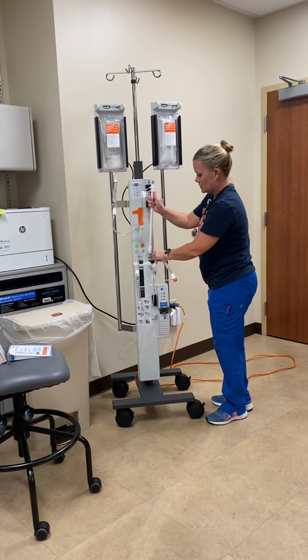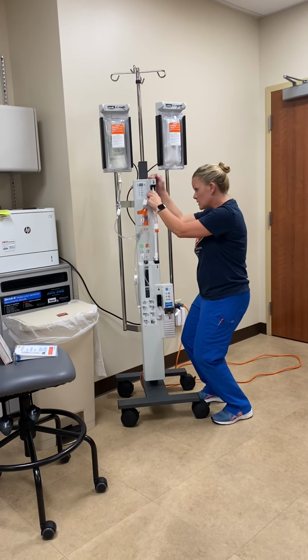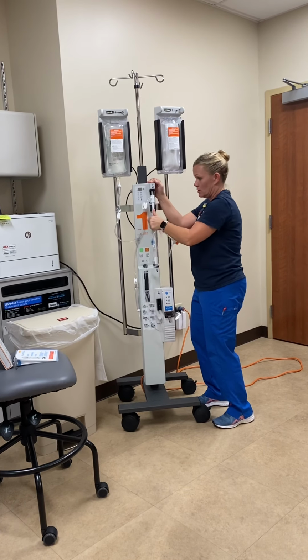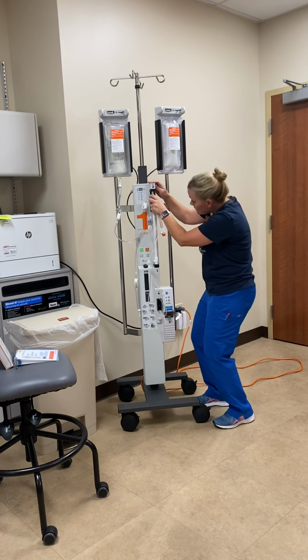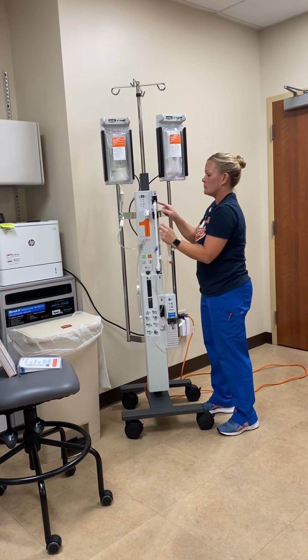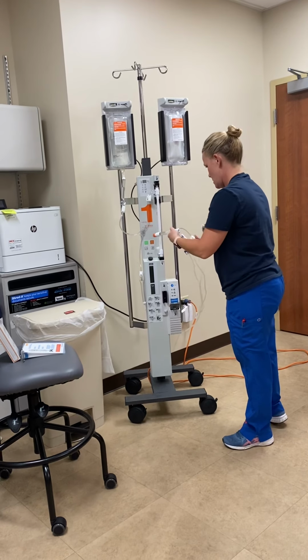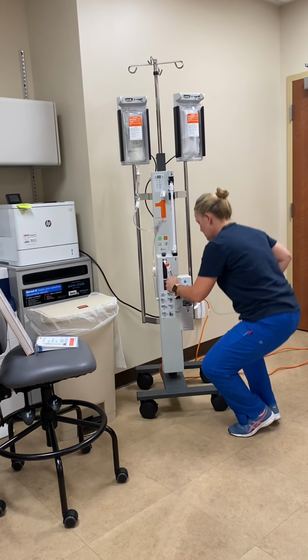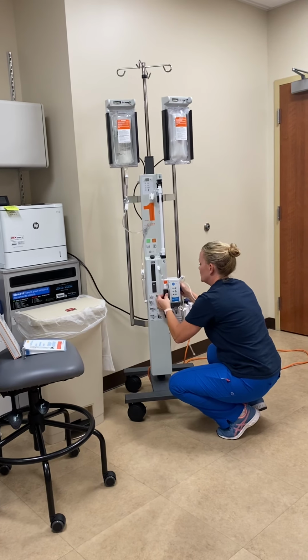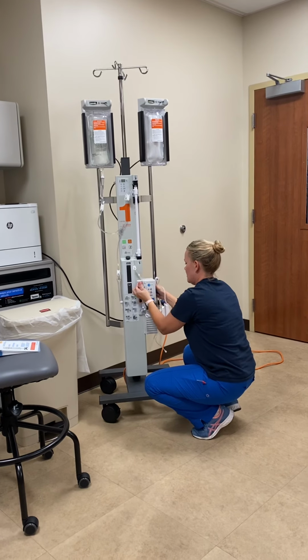There are 2 metal pieces to this part of the tubing. They have to be secured in the holes that are cut out for them, and this has to be pushed, okay? Once you get that set up, you line them up. This lever has to be pulled down to cover some of that metal tubing, okay? And your second chamber goes down here. This is actually what's gonna warm your fluid. This one's a little bit tougher to get pushed in there.